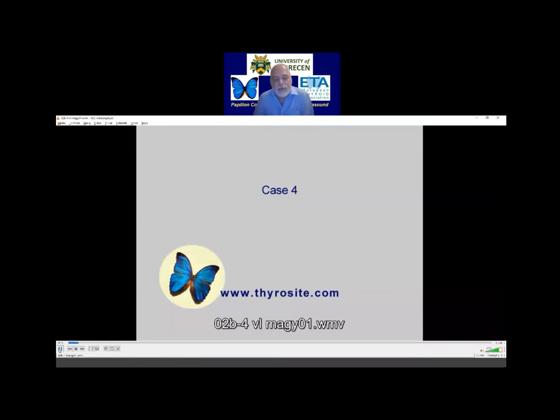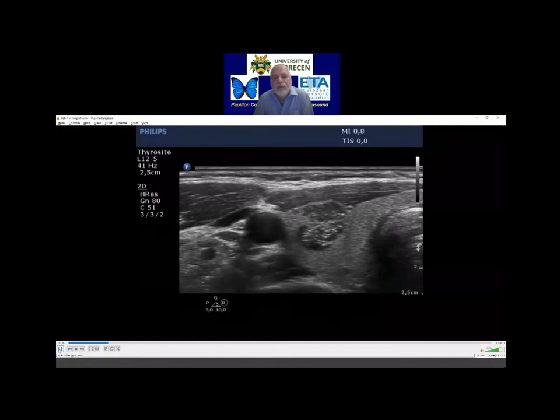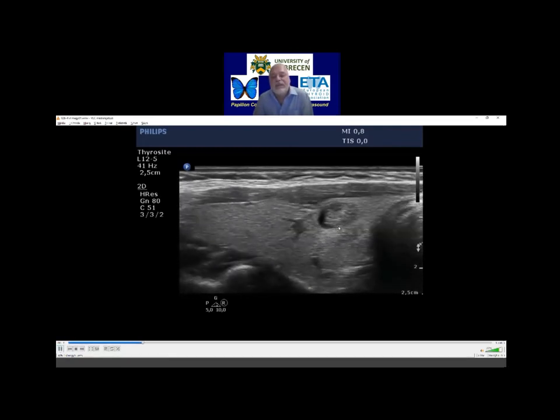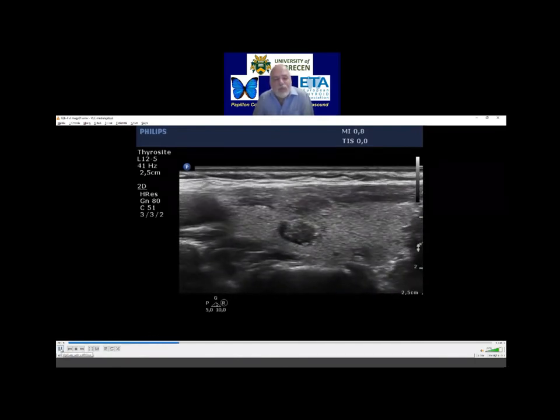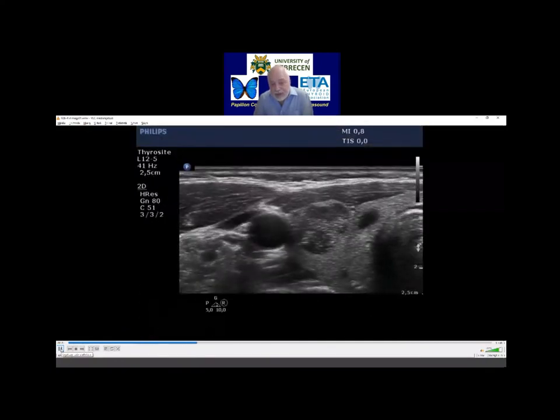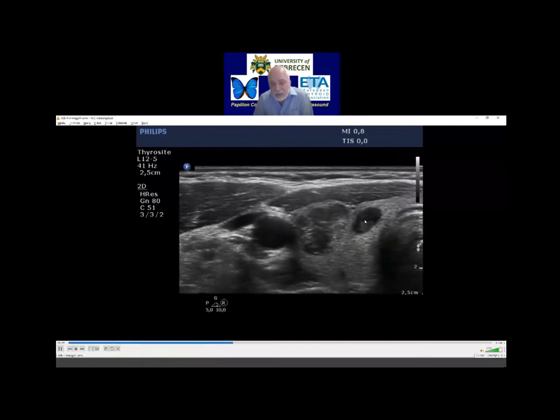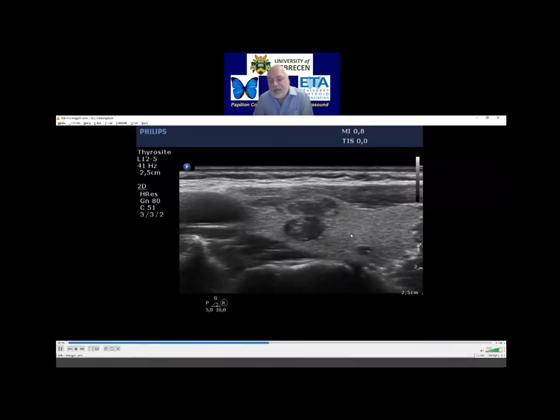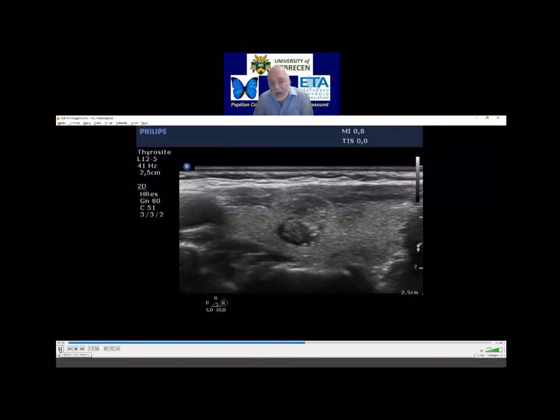I'll show you once more this video for the sake of the third nodule. For this one, please focus on this — it also has synchronous lines and granules, but these occur mostly within solid parts. It has cystic areas as well, yes, but this is a quite large solid area. In such areas, the synchronous presence of lines and granules are the sign of connective tissue.